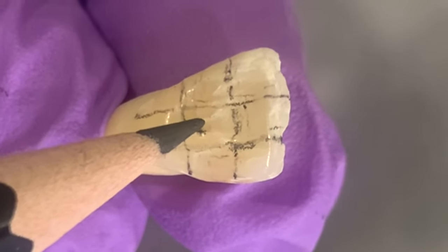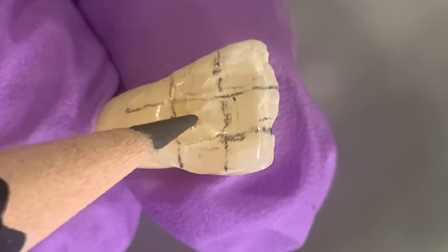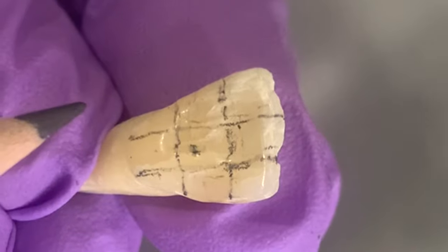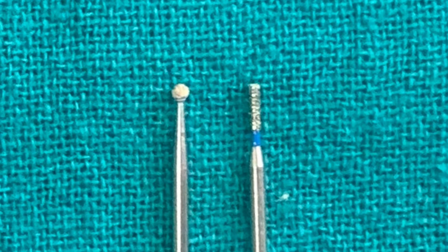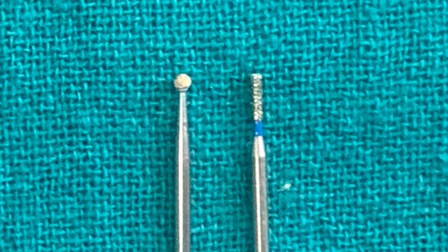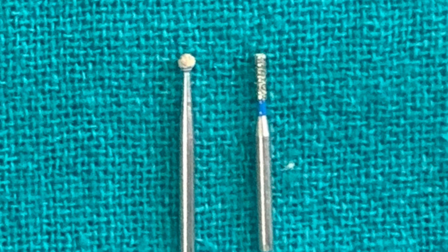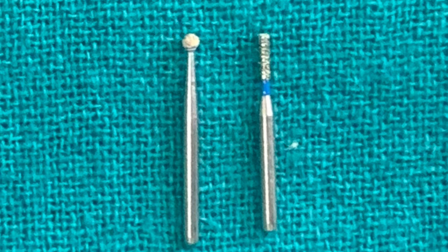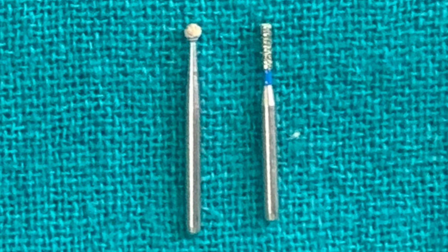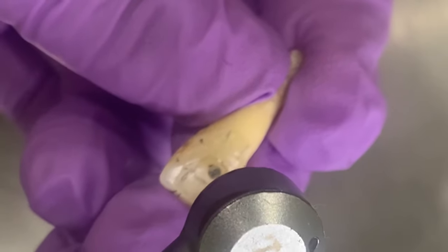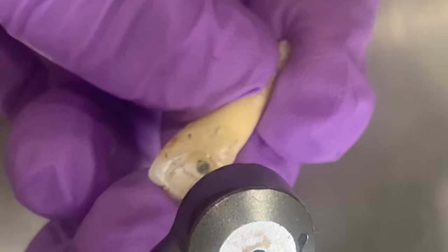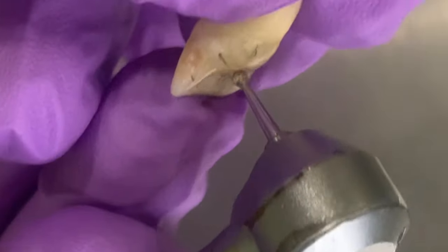This is the point that we have marked. I'm going to use two basic burs: the round bur and the straight bur to prepare the access cavity. We begin with the round bur. We position it perpendicular to the lingual surface of the tooth and we start our cutting in this manner.